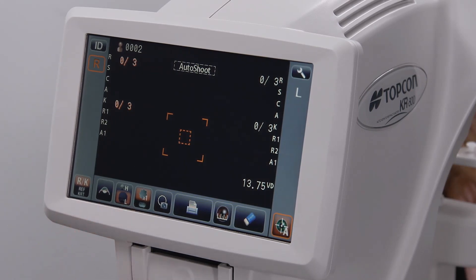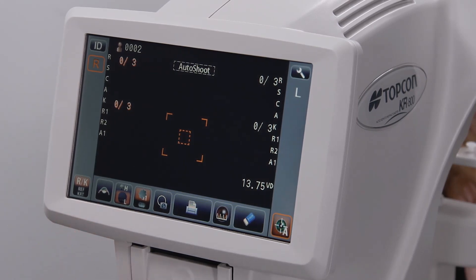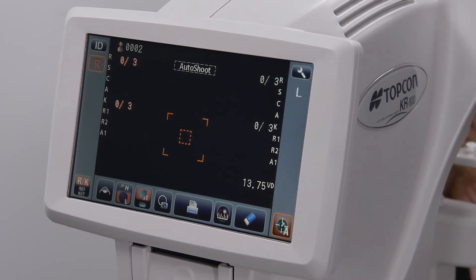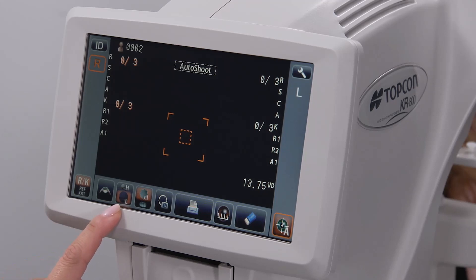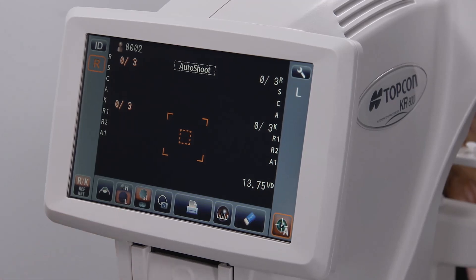The fixation target illumination icon can be used to adjust the brightness of the image that the patient focuses on during testing. On the KR800 and KR800S, this icon provides only a high and low option. Note that on the KR800PA, this icon will allow you to cycle through high, medium, and low illumination.